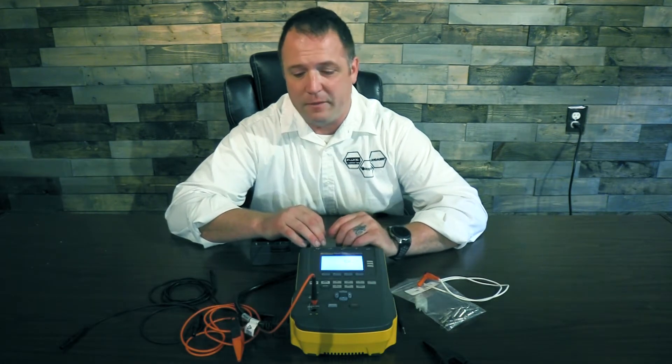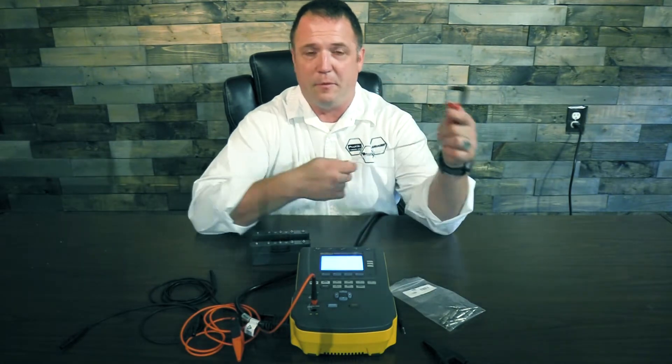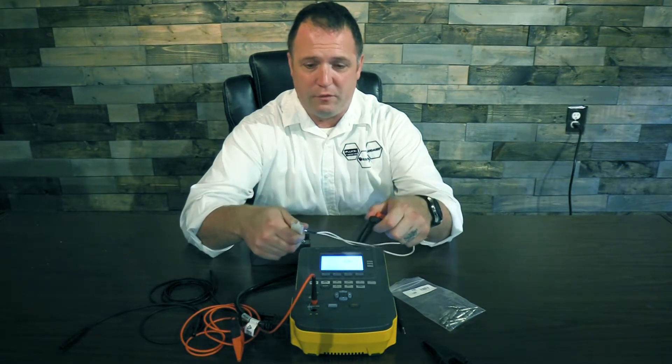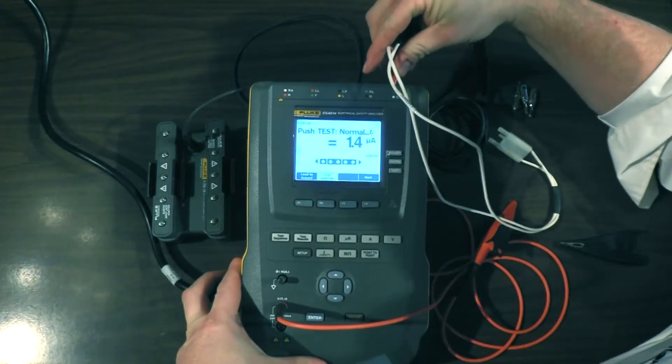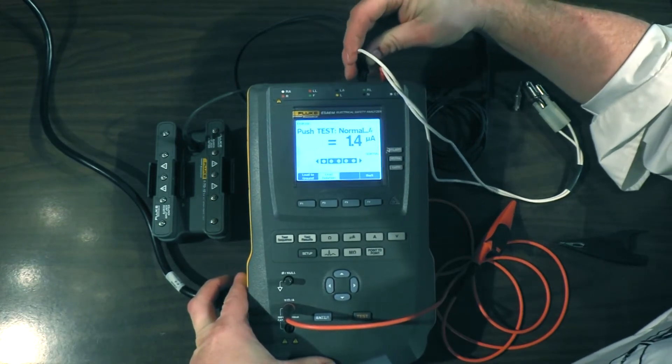We're going to assume our defibrillator is a three-lead or five-lead defibrillator. In order to do that, we're going to need a set of hands-free adapters. You'll get this from your Impulse 7000 — when you're done doing your discharge test, you'll take this out of the Impulse 7000 and simply connect these over here like this. This is our applied parts.